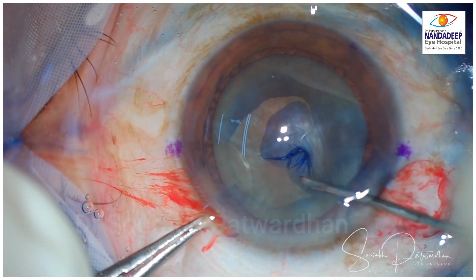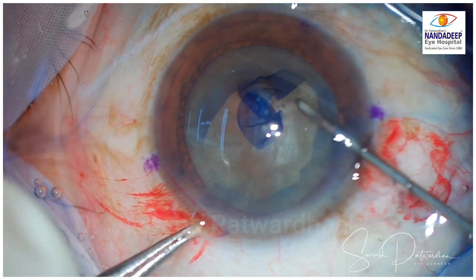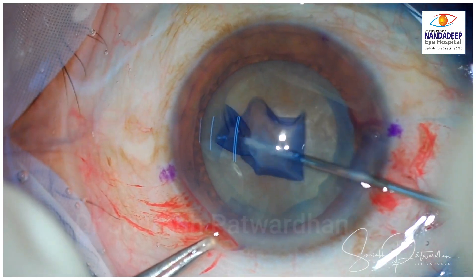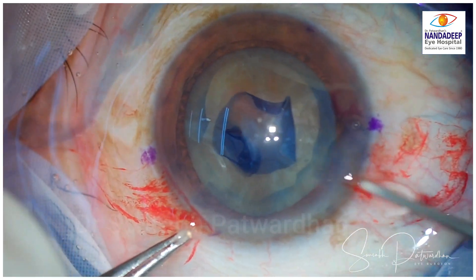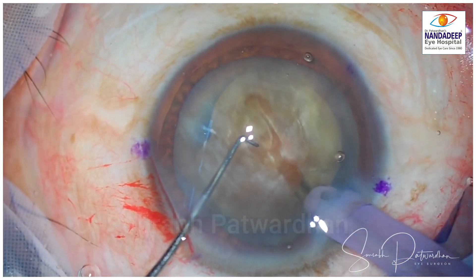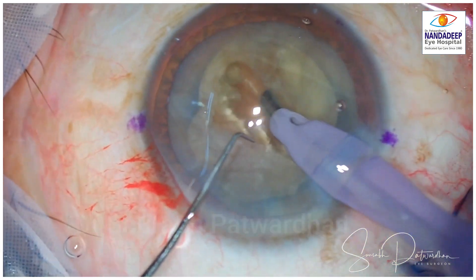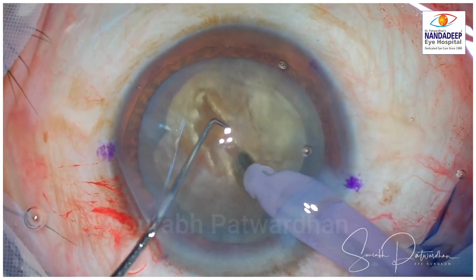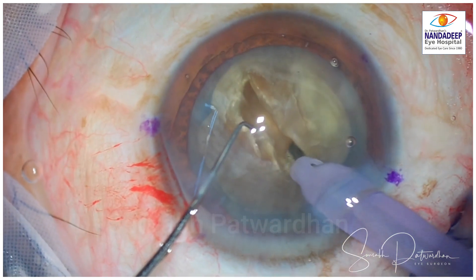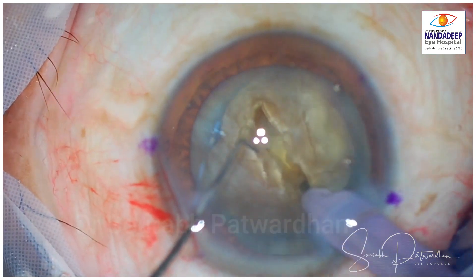My experience with LRI has been that it has a tendency of regression over a period of time, so I generally do not prefer to do LRI for more than 1.25 to 1.5 diopters. Nowadays the cost of toric IOLs has reduced significantly, so my preferred choice is toric IOLs rather than correcting astigmatism using LRI. But in cases of cost concerns and for very small cylinders, say up to 1 diopter, I can consider doing limbal relaxing incision.